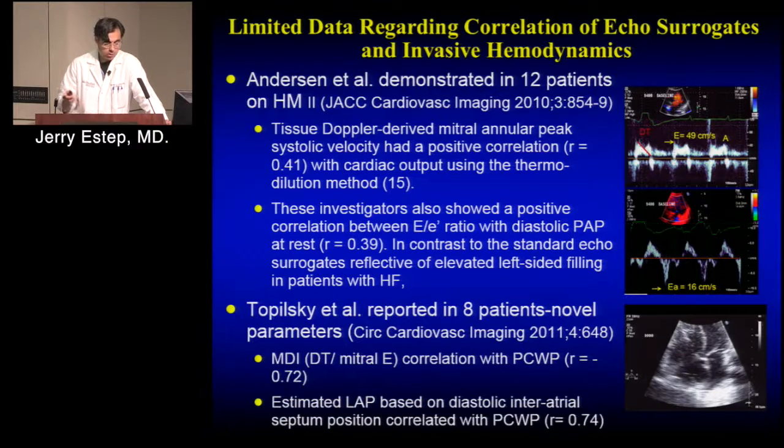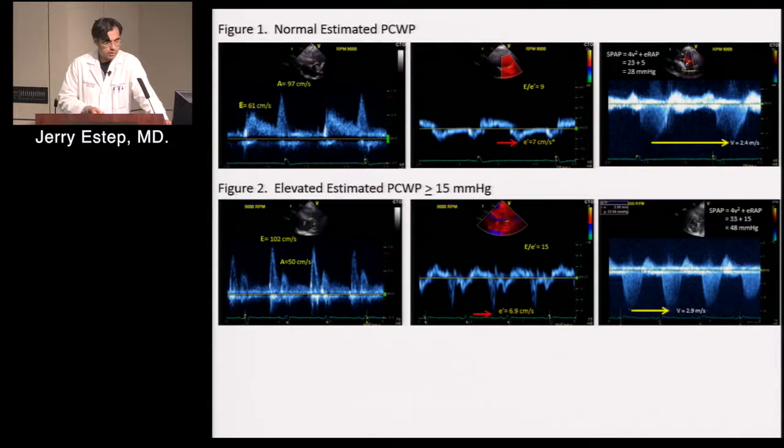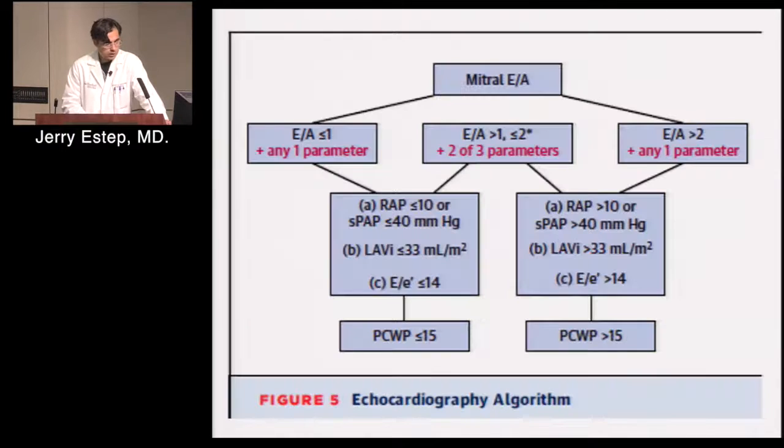Invasive hemodynamics, certainly the group here has been at the forefront of understanding hemodynamics in heart failure patients in general using echo. We too looked at it in patients with an LVAD, and it's the standard Doppler and spectral Doppler estimates. I can tell you what is different when you look at the algorithm. The mitral E/A ratio is at the top, followed by other surrogates of high filling. And so a more than moderate left atrial size coupled with an E/A ratio, for example, greater than 2, is concerning for partial LV unloading.